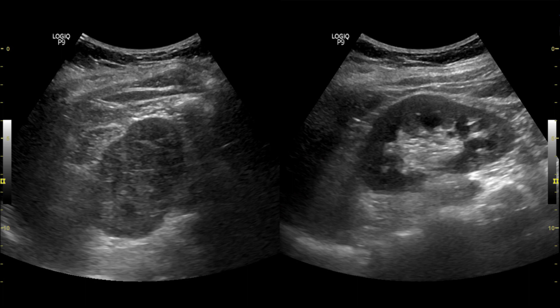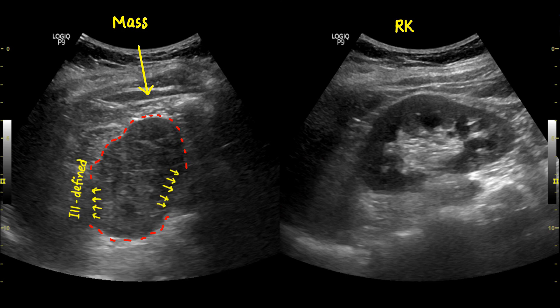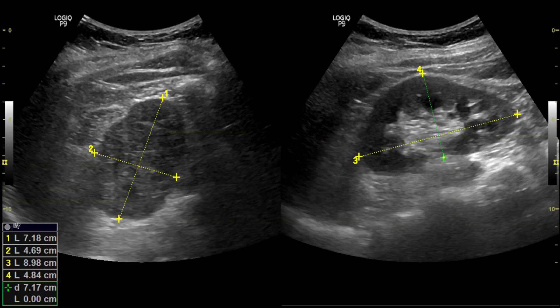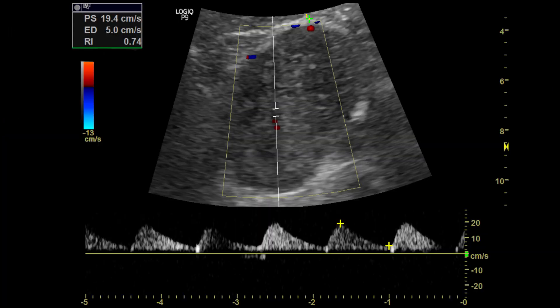Here you can see the hypoecogenic, heterogeneous, ill-defined mass alongside the normal portion of the right kidney. Color Doppler shows flow within the mass.